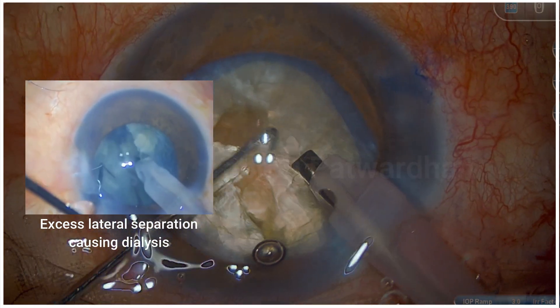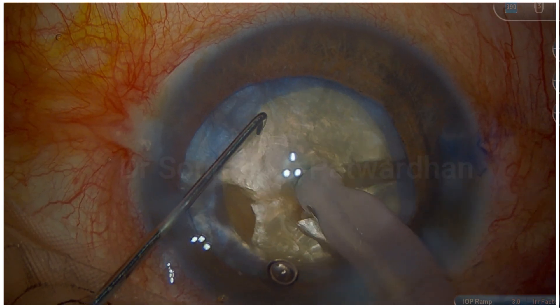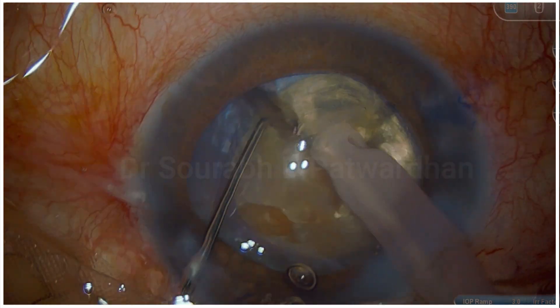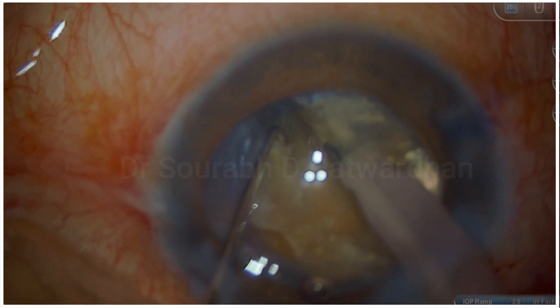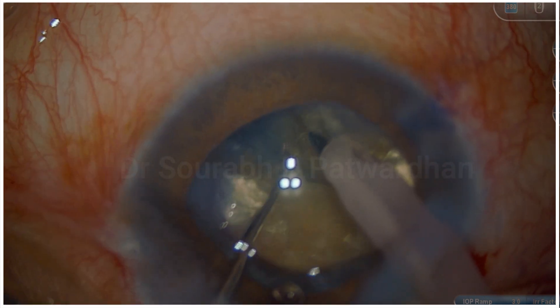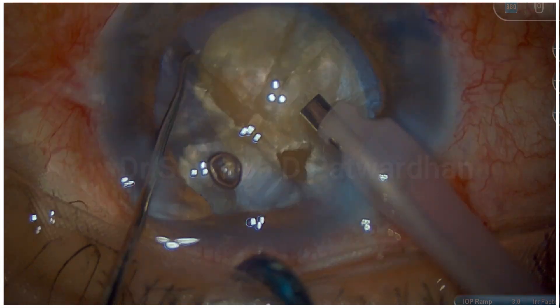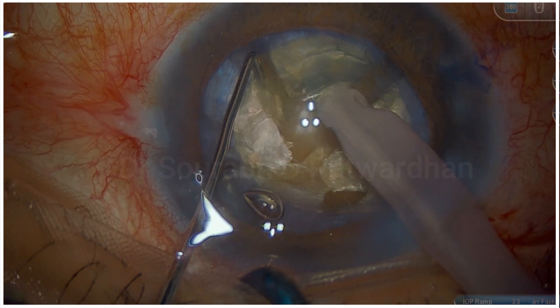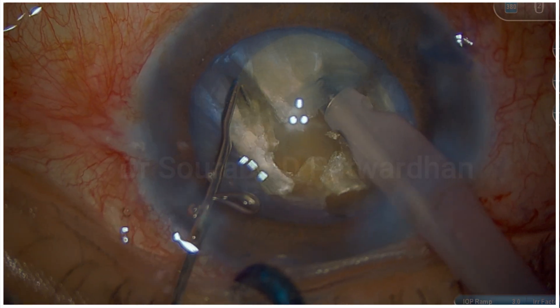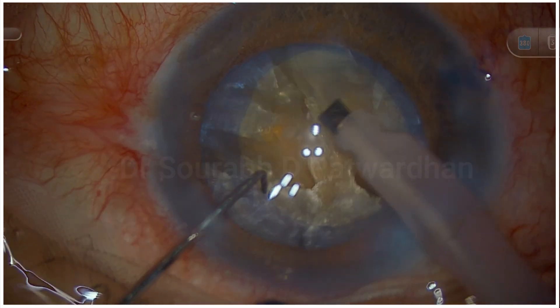The surgeon is thinking: I'm in a situation where the posterior plate is not divided — what should I do? As the coach would have advised, the surgeon now goes deeper. Once the chop is done, the deeper hold on the nucleus is very useful. Going deeper and deeper until reaching the posterior plate, adjusting the microscope focus as well. You can see the chopper went down, down, down, deeper, with separation attempts that were small steps — going slow, slow, slow. In these situations it is always difficult to break the posterior plate.